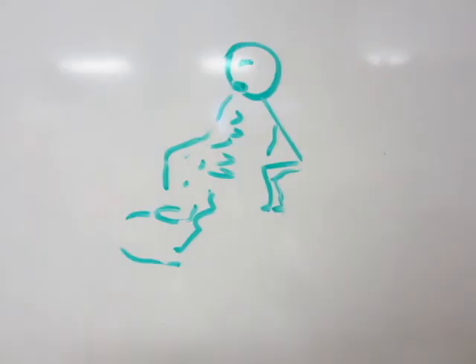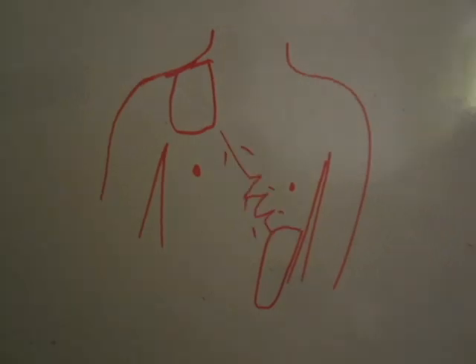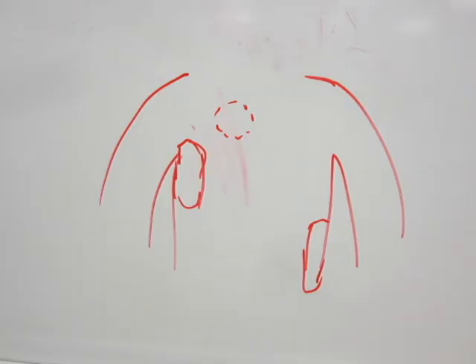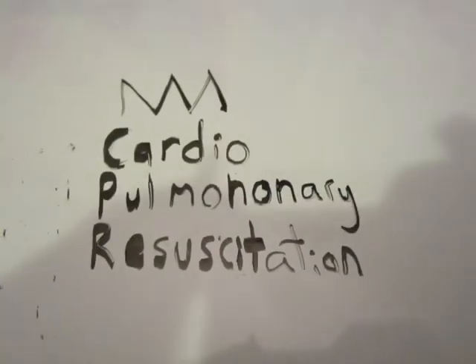If the victim throws up right as the shock is about to be delivered, deliver the shock first, then deal with the vomit. If the victim has an embedded pacemaker on the right side, place the pads at least 1 inch away from that pacemaker. That's CPR with AED.